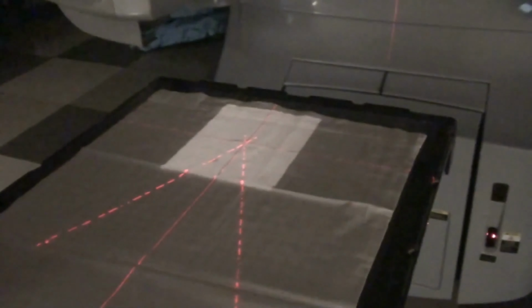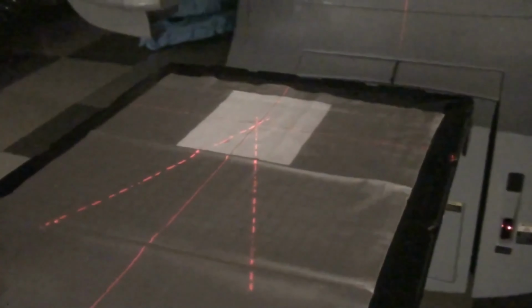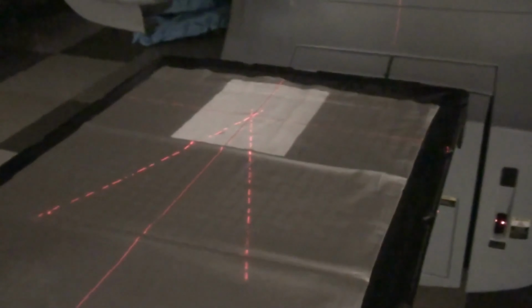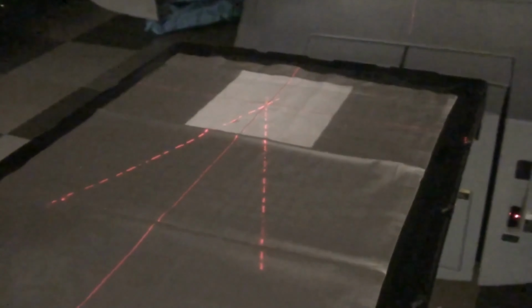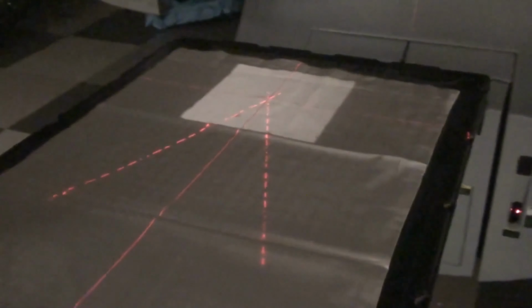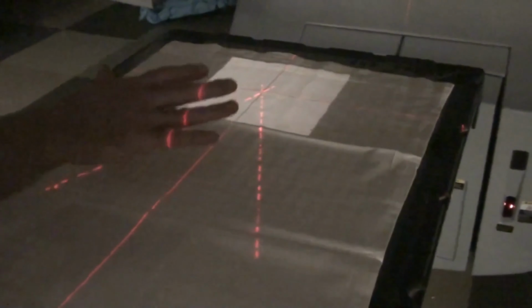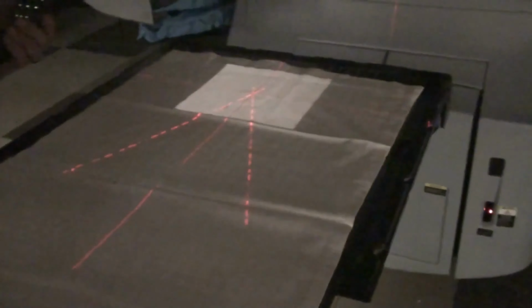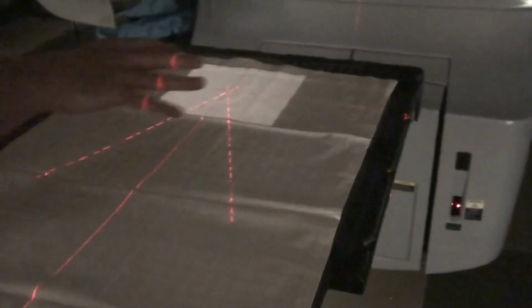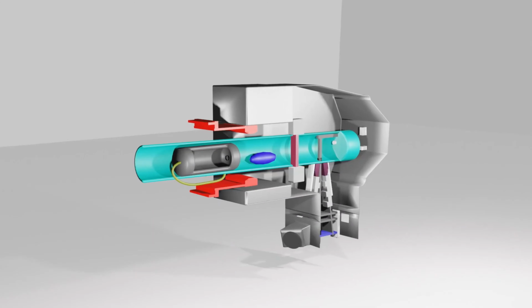The radiation beam is defined by a manually adjustable slope-sided collimator assembly. This collimator allows a fixed rectangular field to be obtained. Point detector techniques and the F5 tally are used to calculate the gamma ray flux at different points in the path, and the ANS photon flux-to-dose conversion factor is used to determine the dose rate. 10 million photon histories are used to accumulate the tallies, which are normalized to the cobalt source. The statistical uncertainties of the results range between 1 to 3% for all tally values.